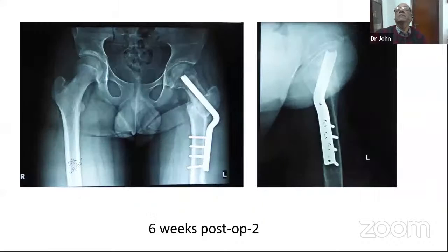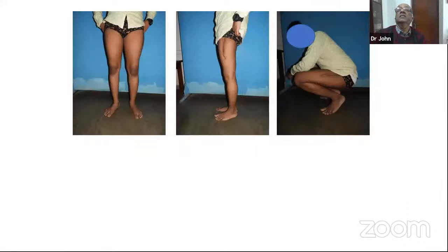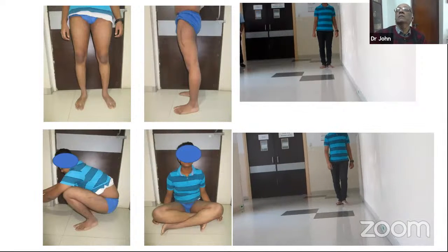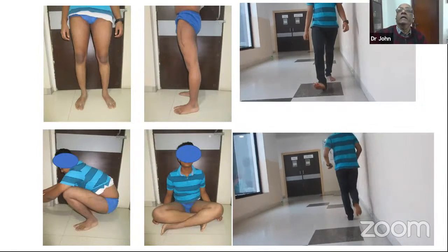Okay, so anyway, this is him at 6 weeks. That hasn't luckily been a problem. He's going on to form bone here as well, quite well. This is him at 4 months. Again, the important thing about the lateralization is that you get the axis properly corrected. Otherwise, you can have a long-term effect on the knee joint. And this is him at that stage. And then finally, at 7 months post-op, you can see how it's nicely gone on to heal. And that's him clinically. He's able to run. He's able to walk comfortably without a significant limp either.